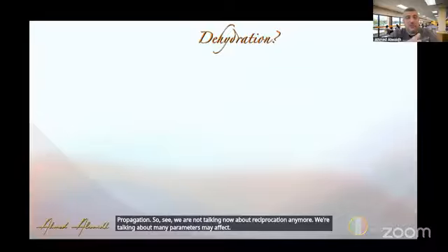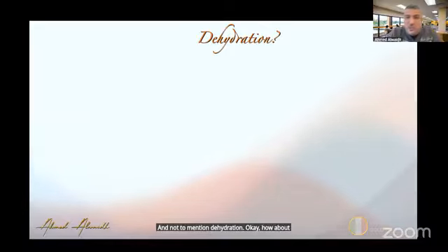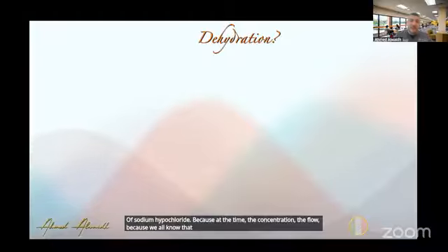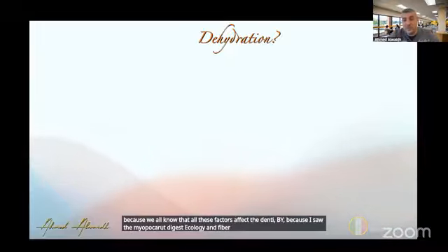And not to mention dehydration. How about dehydration? The use of sodium hypochlorite, because of the time, the concentration, the flow, because we all know that all these factors affect the dentine. Why? Because sodium hypochlorite digests collagen fiber, which makes up 23% of dentine.